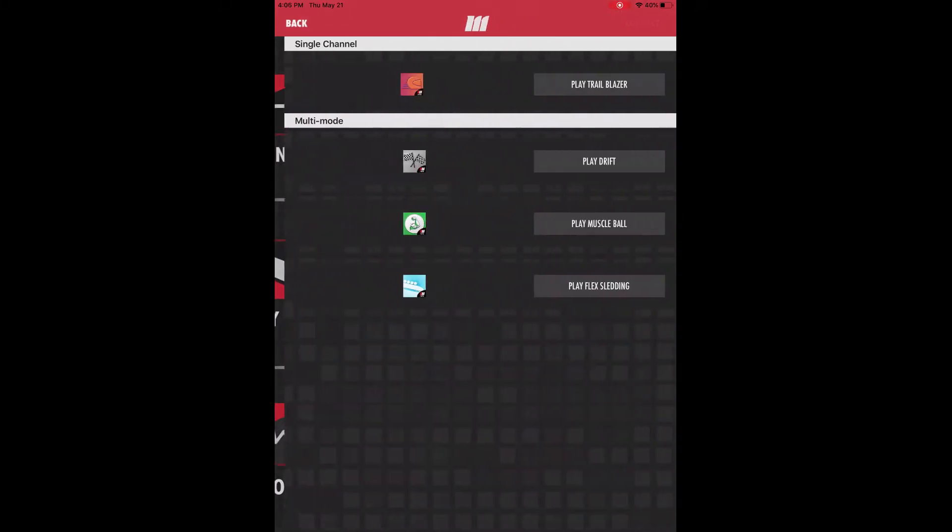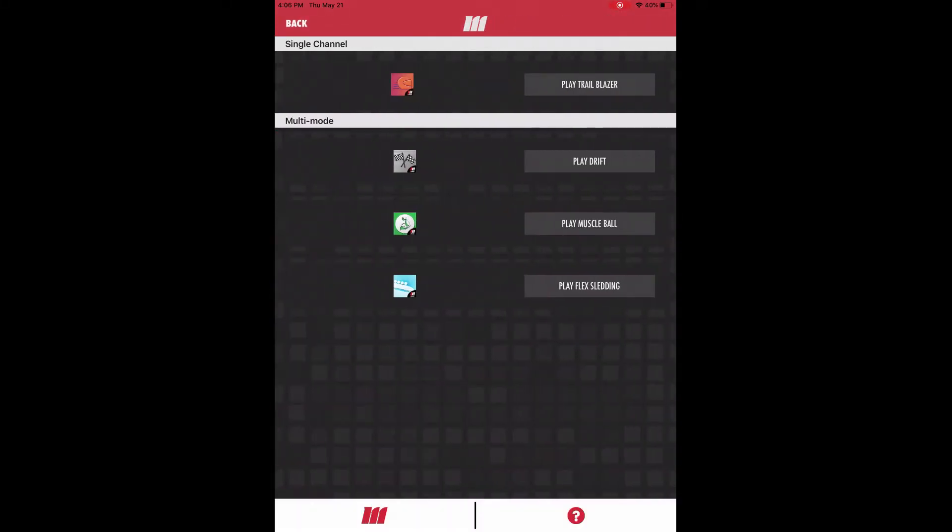In the play module, you'll see our games broken down into two categories. In the single channel category, we have Trailblazer.